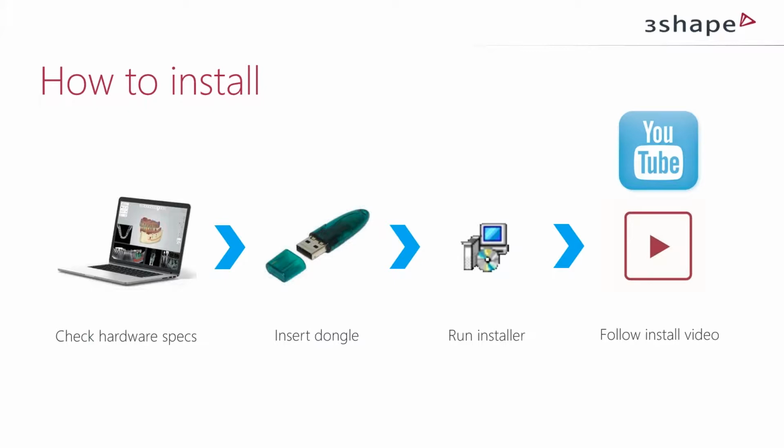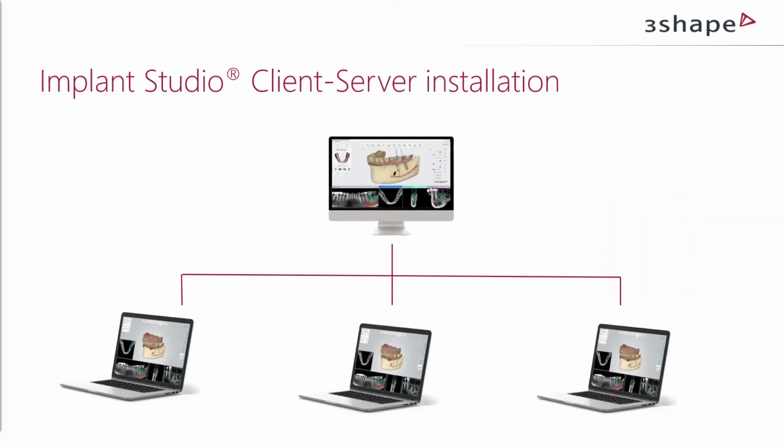It's very important. Then we follow the instructions in the training video to install the software, because we have a training video. You will get this presentation after the webinar, so you can go to our 3Shape YouTube channel and find the how to install Implant Studio 2016 video.